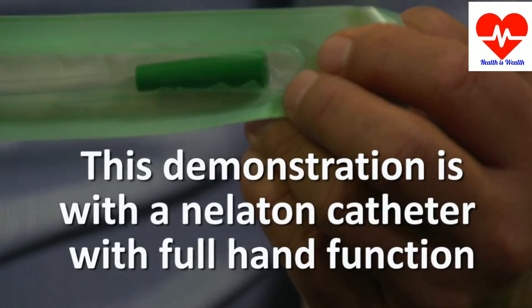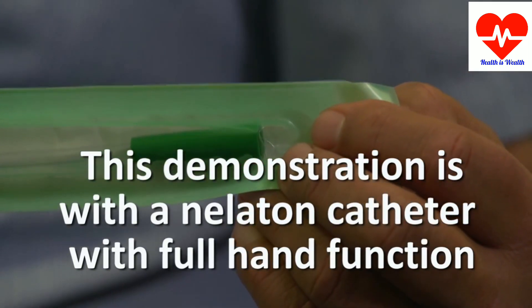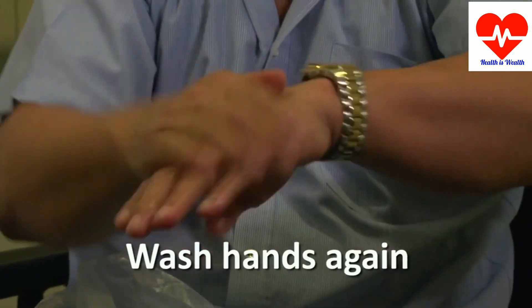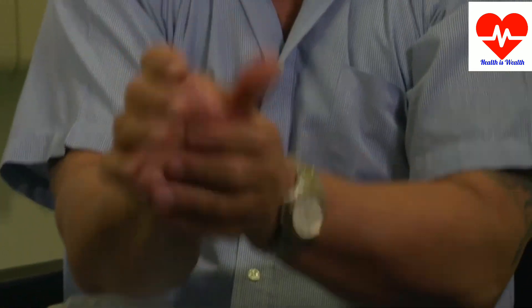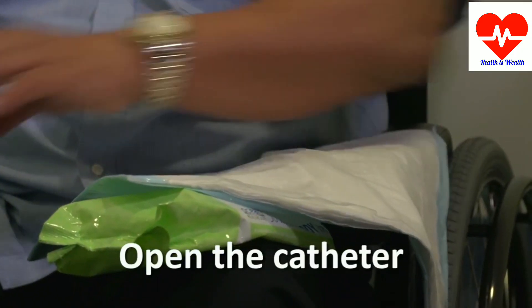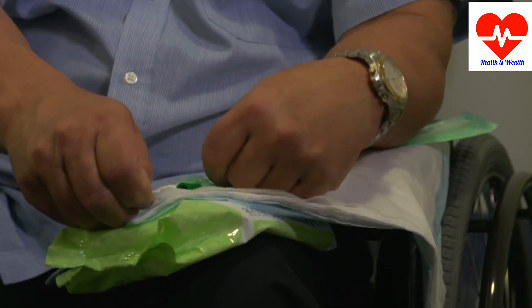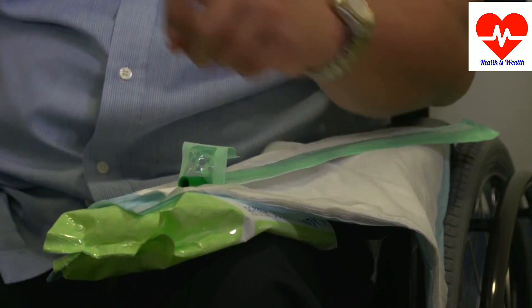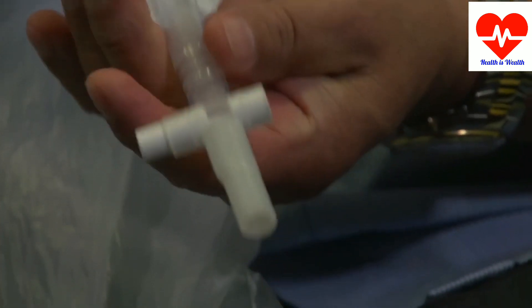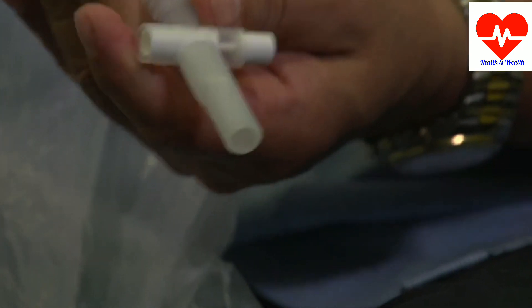Some of the details might change if you have limited hand function, but the basic principles are the same. Now I've got all my equipment ready. I wash my hands again. Open the catheter but make sure it stays in the sterile packet. Sometimes placing a fold along the length of the packaging helps the catheter to remain in place. Attach the catheter bag or extension tubing — it's really important to make sure that the catheter bag drainage valve is closed before you attach.